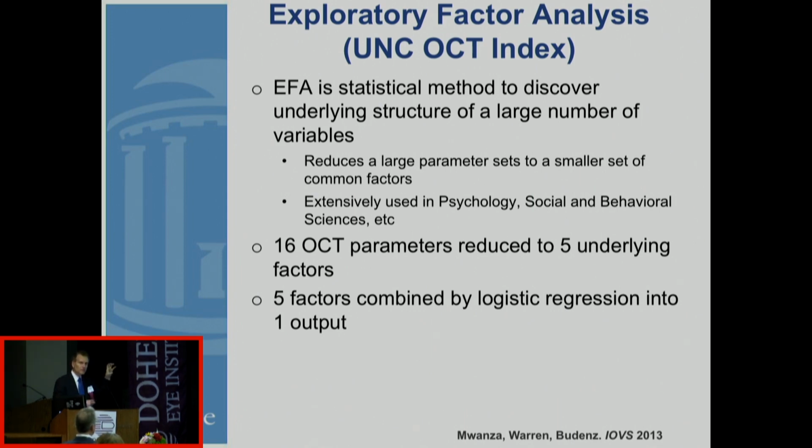Can we bunch factors that are telling us the same thing and separate them from factors that tell us different things?